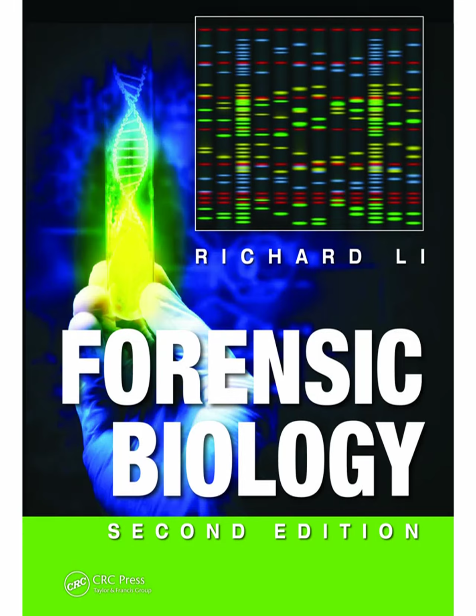Sure. Imagine a small plastic well. First, you coat the bottom with an antibody, the capture antibody. Then you add your sample extract. If the target antigen, say PSA, is present, it binds to that capture antibody. Okay, so it's stuck there. Right. Then you wash away everything else. Next, you add a second antibody that also recognizes PSA, but this one has an enzyme attached to it, like a little flag. This binds to the captured PSA, forming the sandwich, antibody, antigen, antibody. The sandwich. Got it. Finally, you add a chemical substrate. The enzyme flag reacts with it, producing a color.